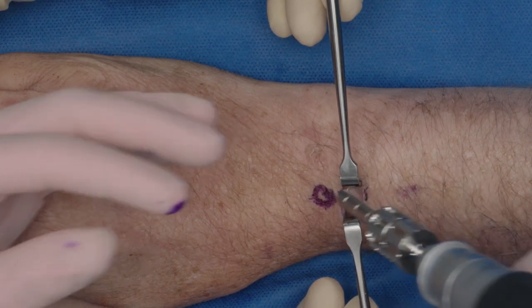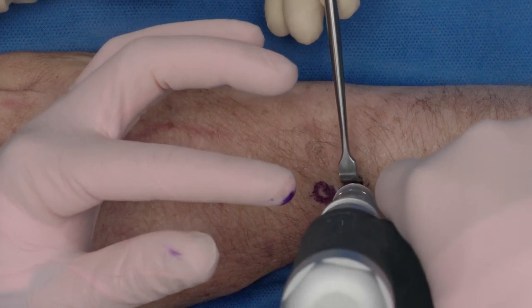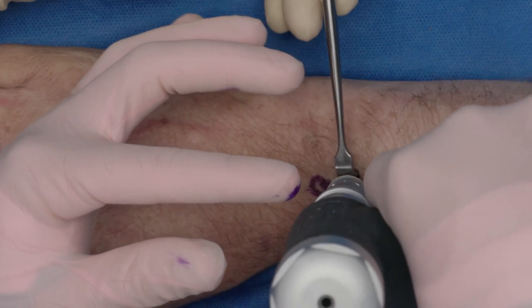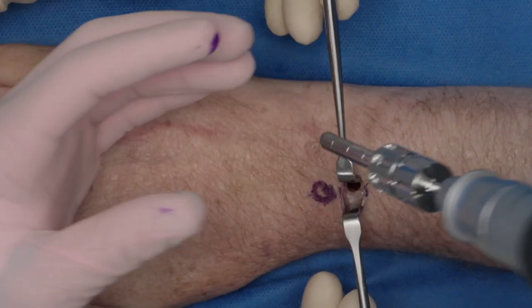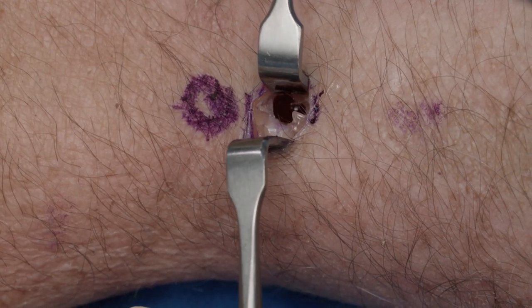When we start drilling, you start off bone so that it doesn't skive. You can gently plunge into the radius, but you want to make sure you do not go through the volar or the opposite cortex, depending on where you are, because you don't want to violate both sides of the bone.